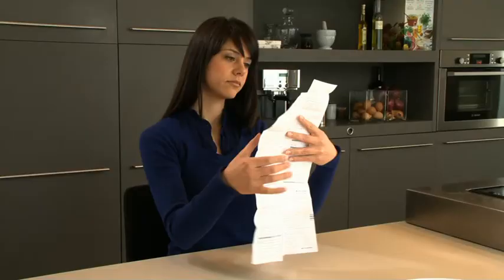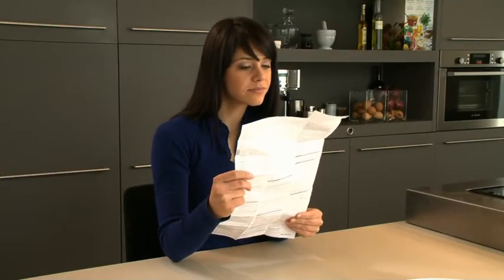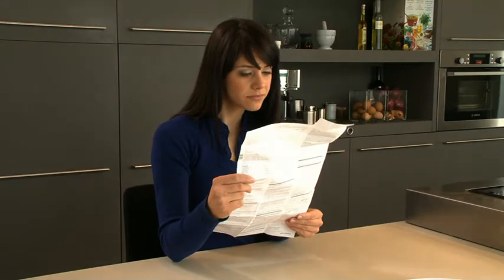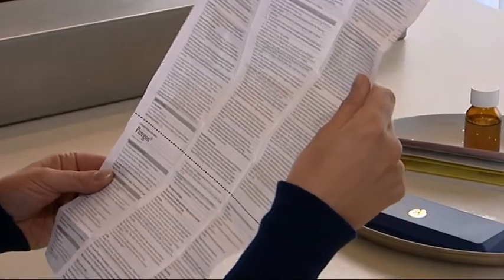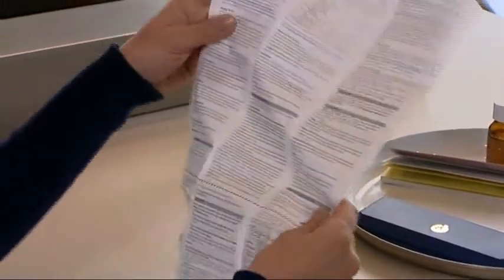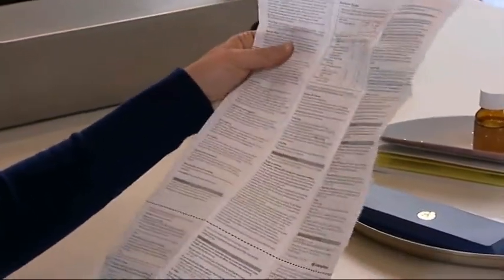You should also read the instructions included with your Puregon pen and cartridge pack. If you have any further questions about Puregon or the Puregon pen, write them down and ask your doctor or nurse during your next visit.